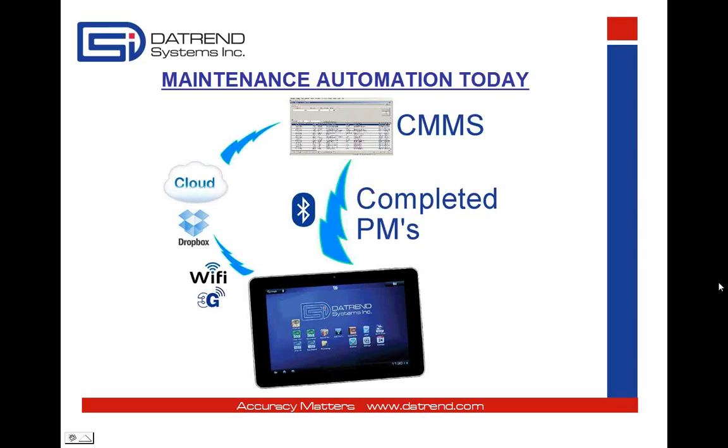Similar to a system that works with a med tester, the CMMS may have the ability to close open work orders and update the equipment inventory automatically. As with the original med tester Sentinel system, there is no paperwork involved.